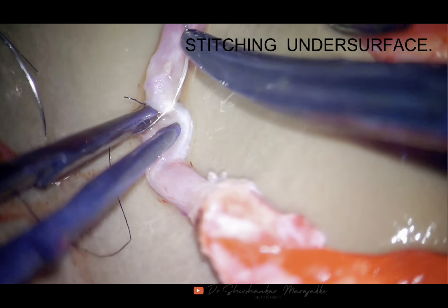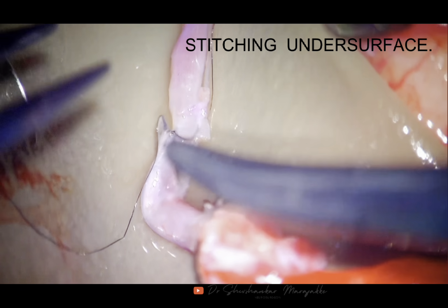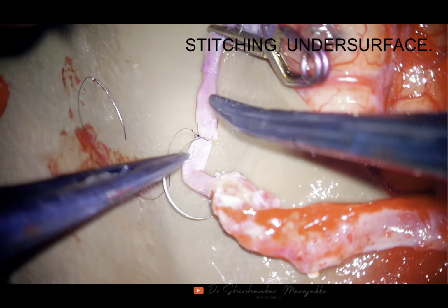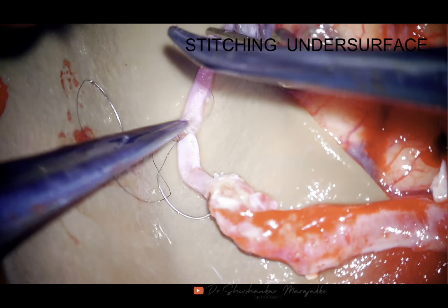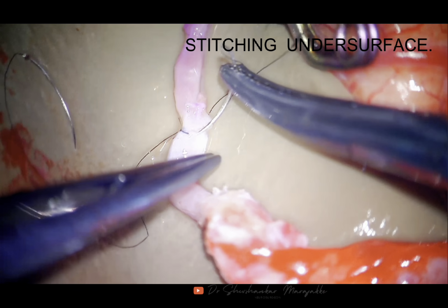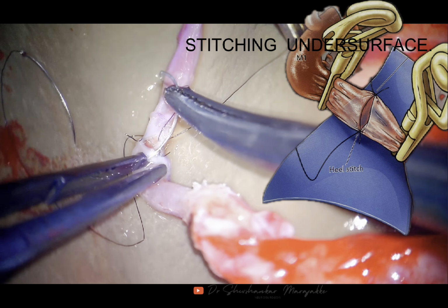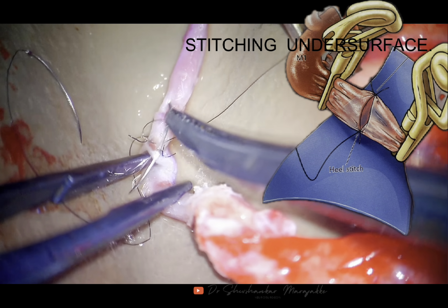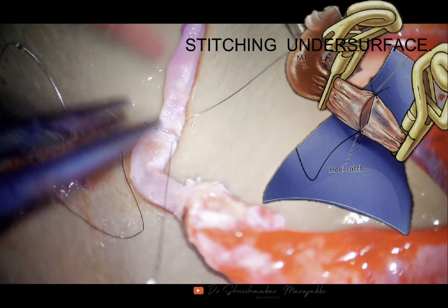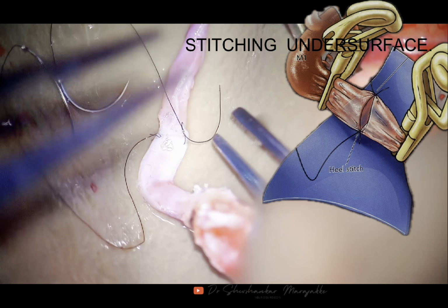I use interrupted sutures in all cases, and I prefer interrupted rather than continuous. You can see that the shanks of the aneurysm clip blades are sufficient to hold the rotated position, or sometimes you might have to keep cottonoids to keep the vessels in this position. You can see in the picture how the vessels are brought into view. This continues with three more sutures.